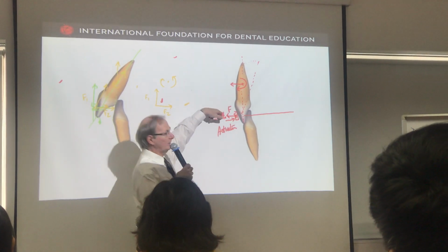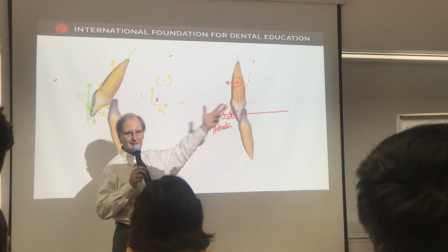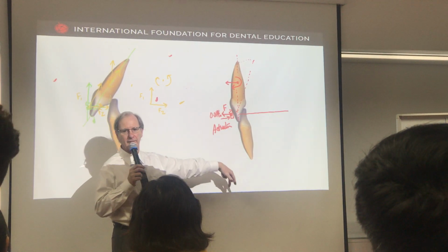This is the system you get with the straight wire. Is that the right moment? Is that the right movement? It's exactly the reverse of what you want.